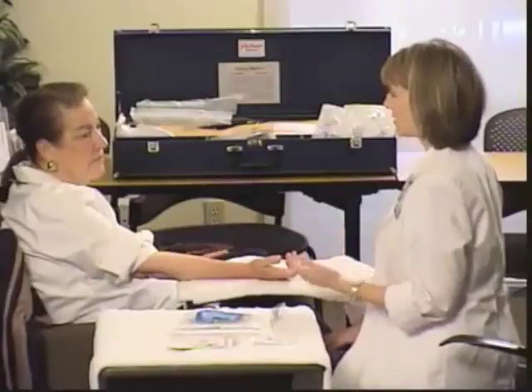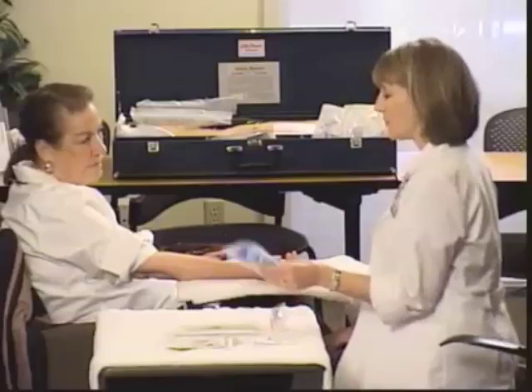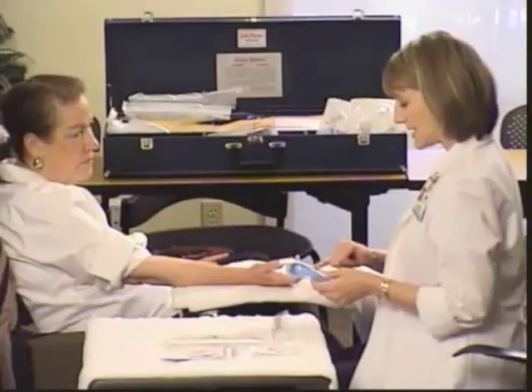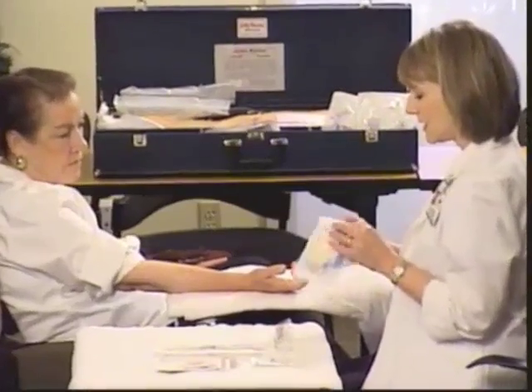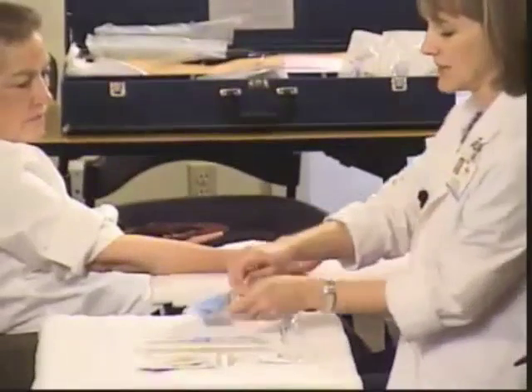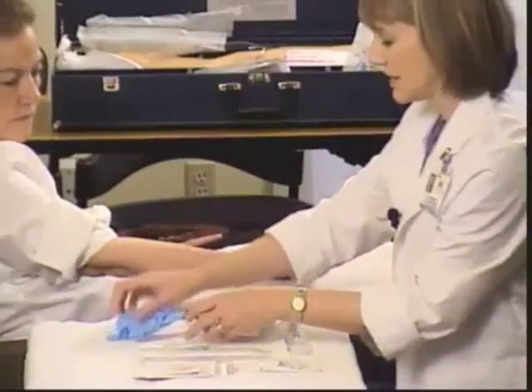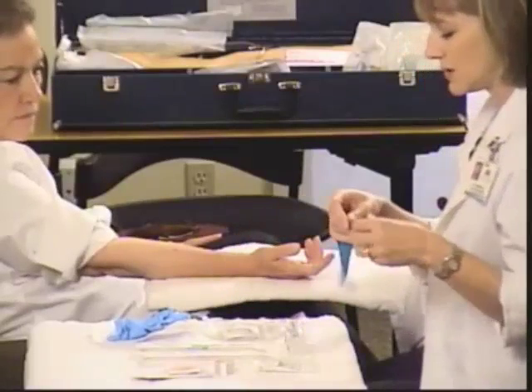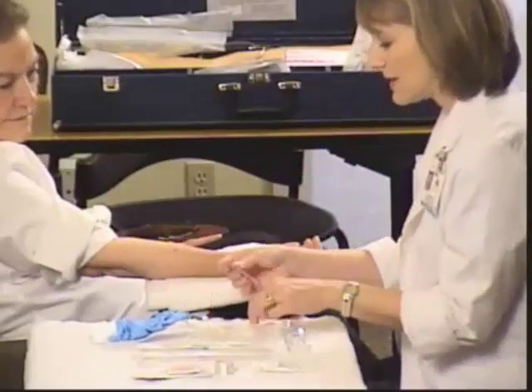We're going to pick up with actually coming into the room and starting the IV. When picking out equipment to bring in, we want to be sure we have the IV start kit, which will always tell you what's inside. In this case it has our gloves, tourniquet, and everything. We'll open it up to get the tourniquet out and do a little setup. We've got our gloves, tourniquet — and remember we can opt to use the blood pressure cuff on an older adult — we've got our tape and stuff to cleanse with.